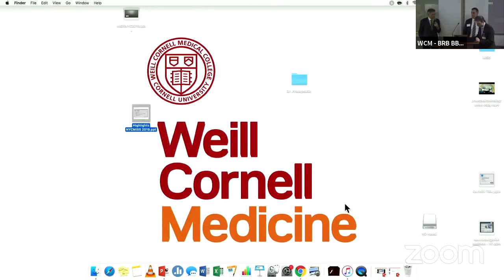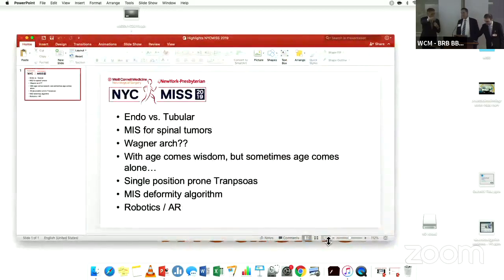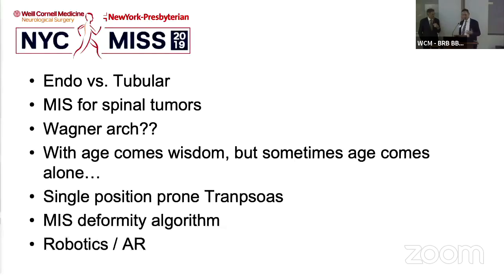Is there any reason why you wouldn't be able to use it like with an exoscope kind of setup where you have a camera and then you look at a display, you just look straight ahead, or do you think that's not a good idea? Yeah, well, I think that's the concept, we're trying to get away from having a remote image display and the attention is on the patient. Right.